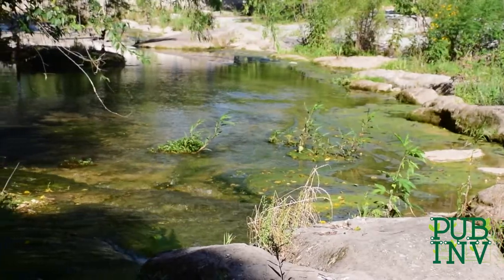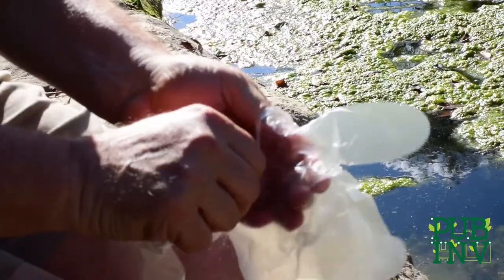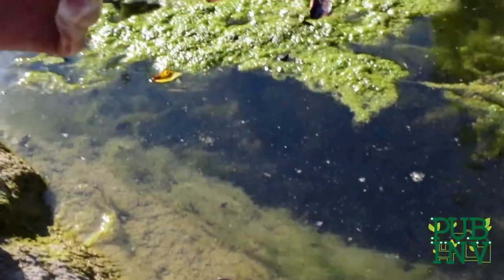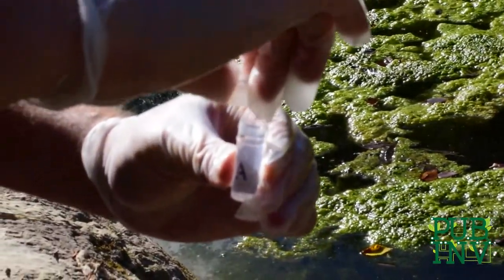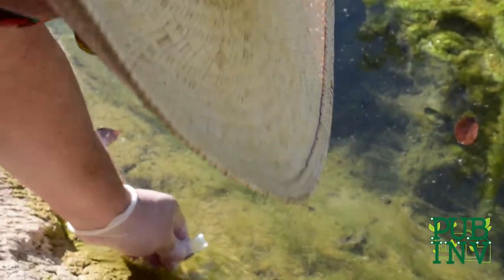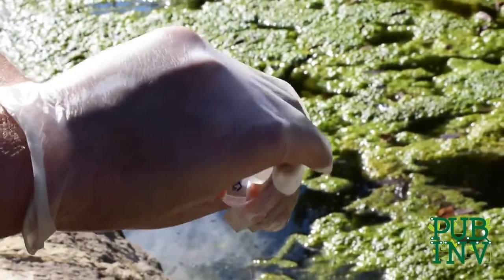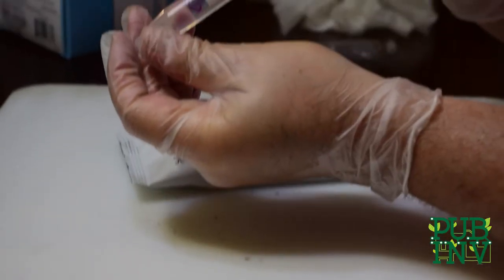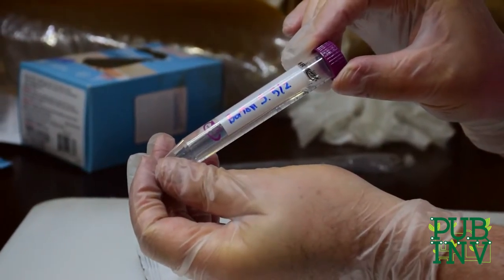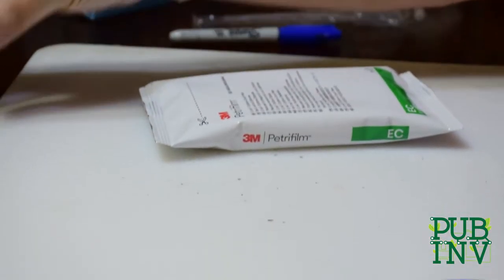Once you've arrived at your chosen water source, make sure you take a picture so you can share it with us. Put on 1 pair of gloves and take your vials and fill each with water from the body of water. Remove the gloves and wash your hands afterwards. Write down where you took the sample A and sample B, with details such as east side of Bullfrog Creek below the city falls. Return home and make sure you wash your hands.